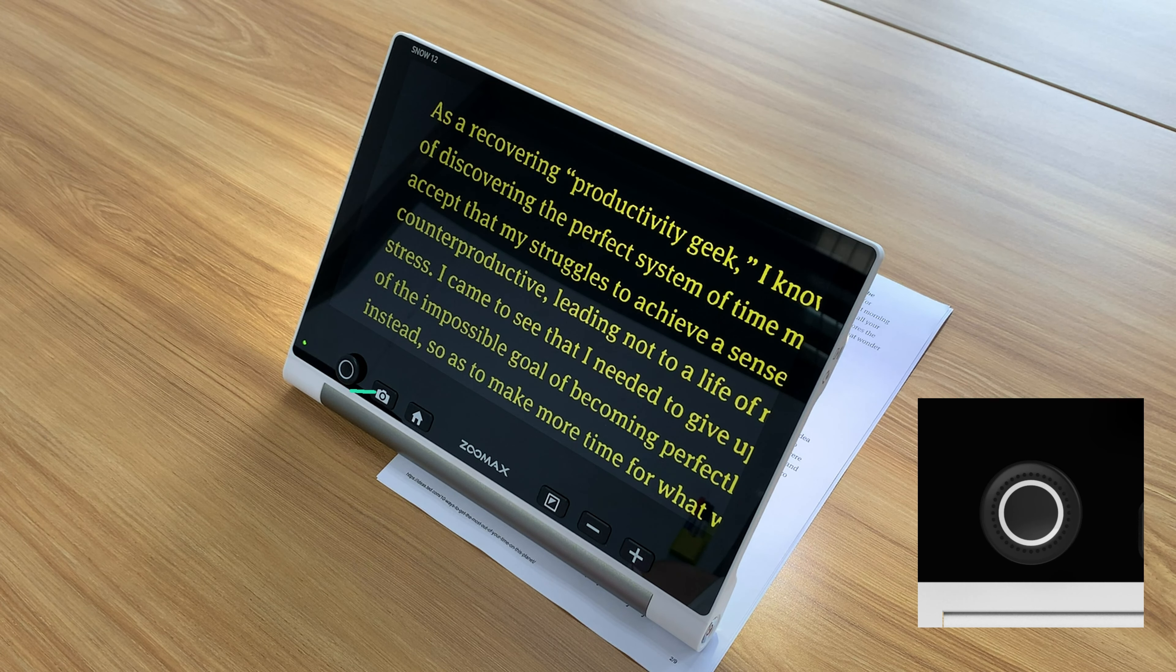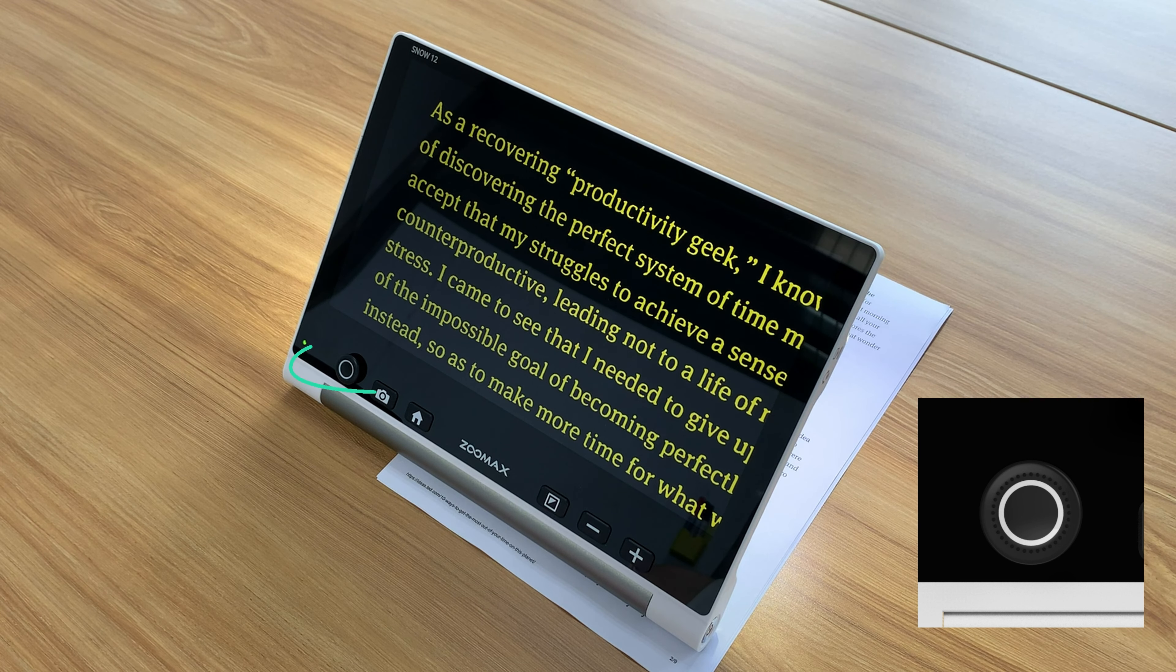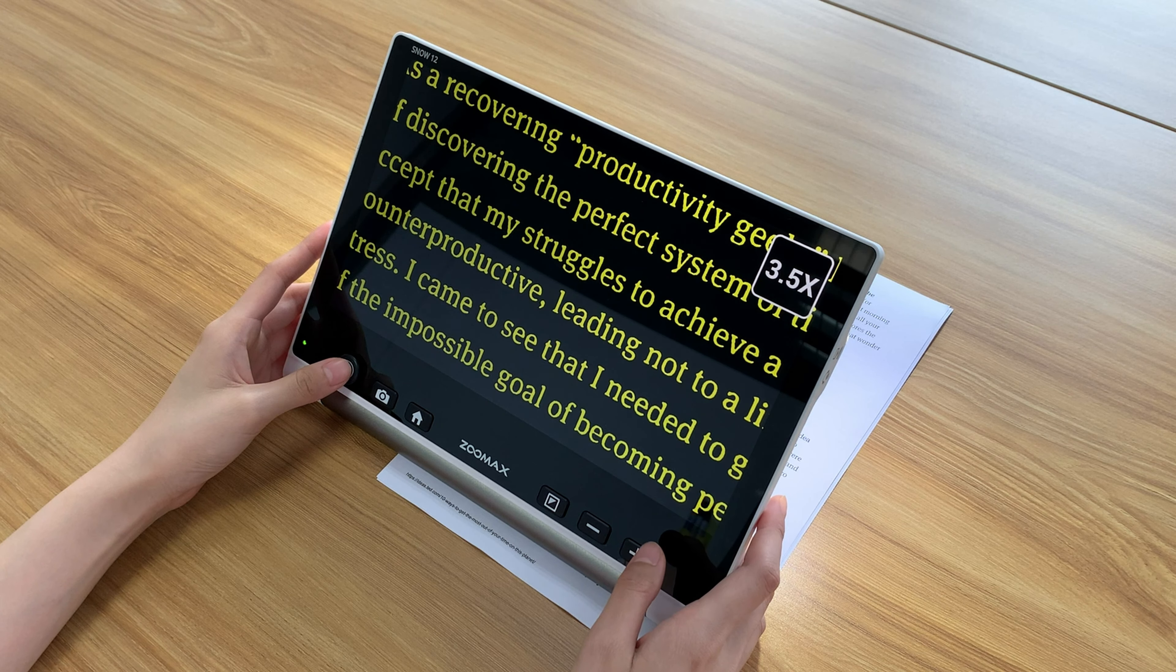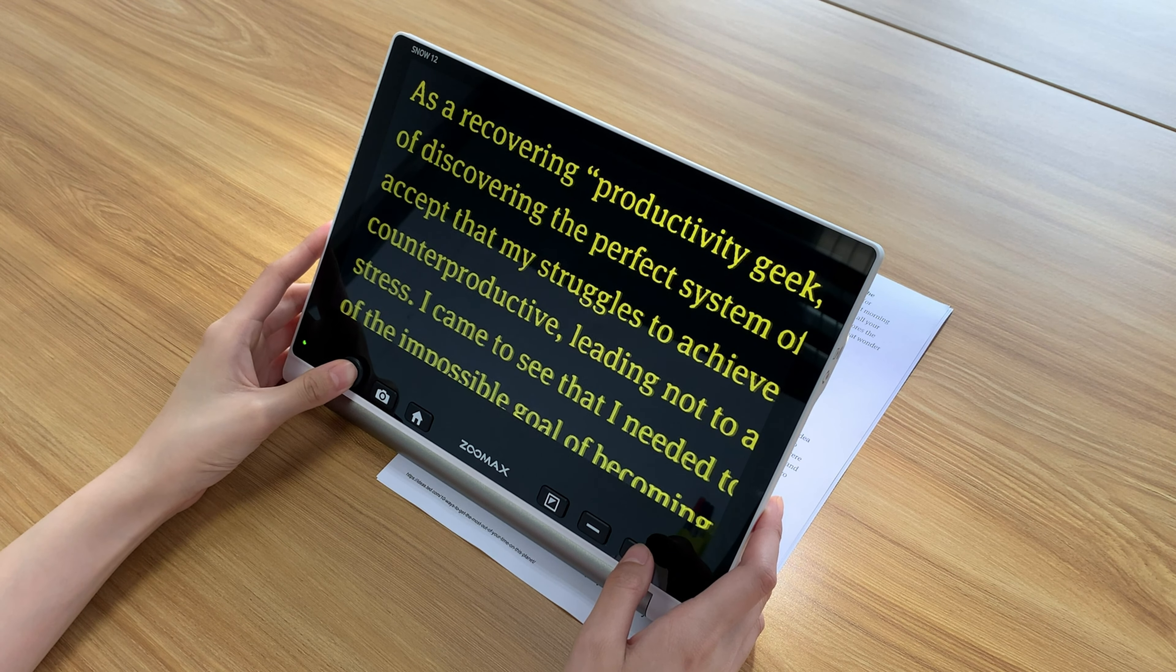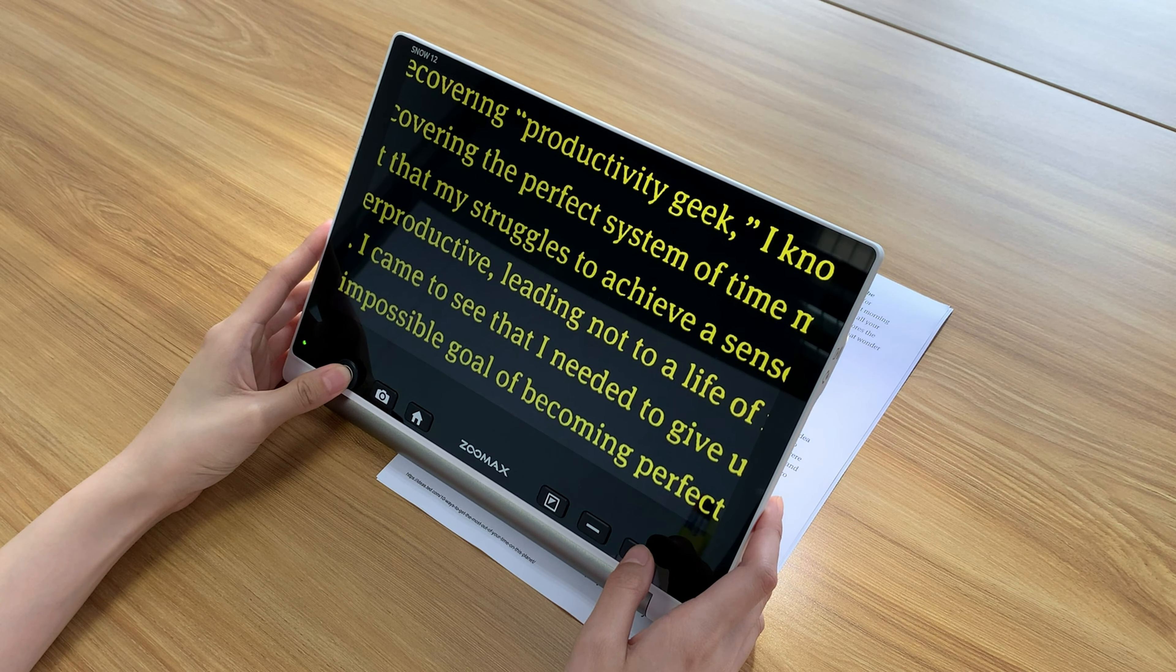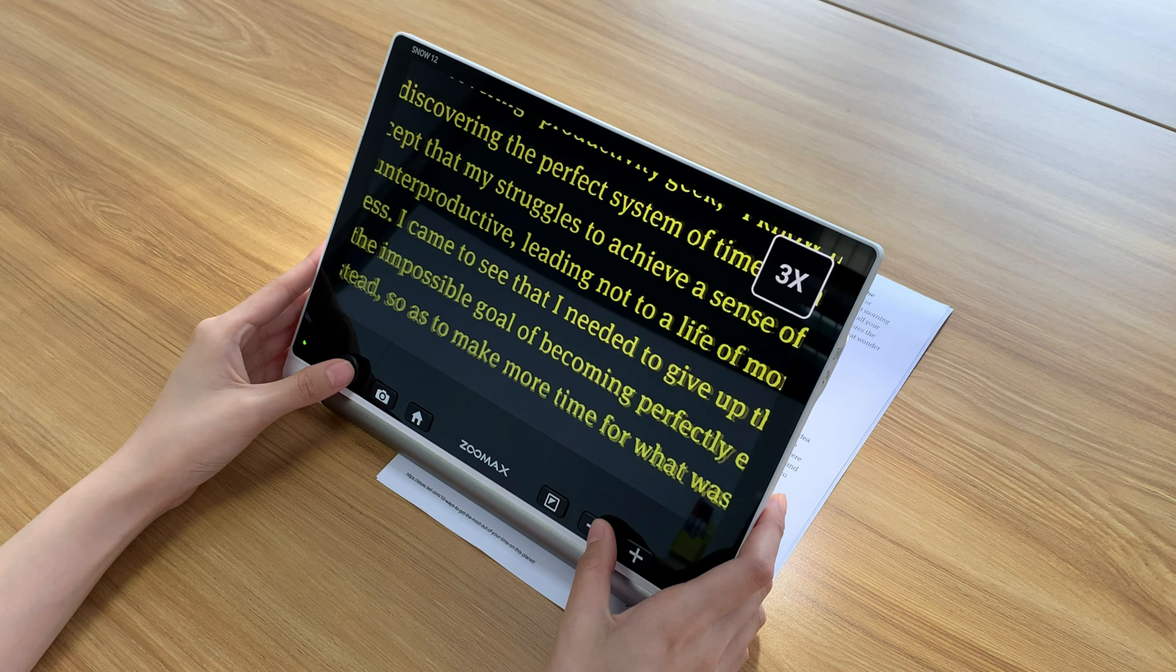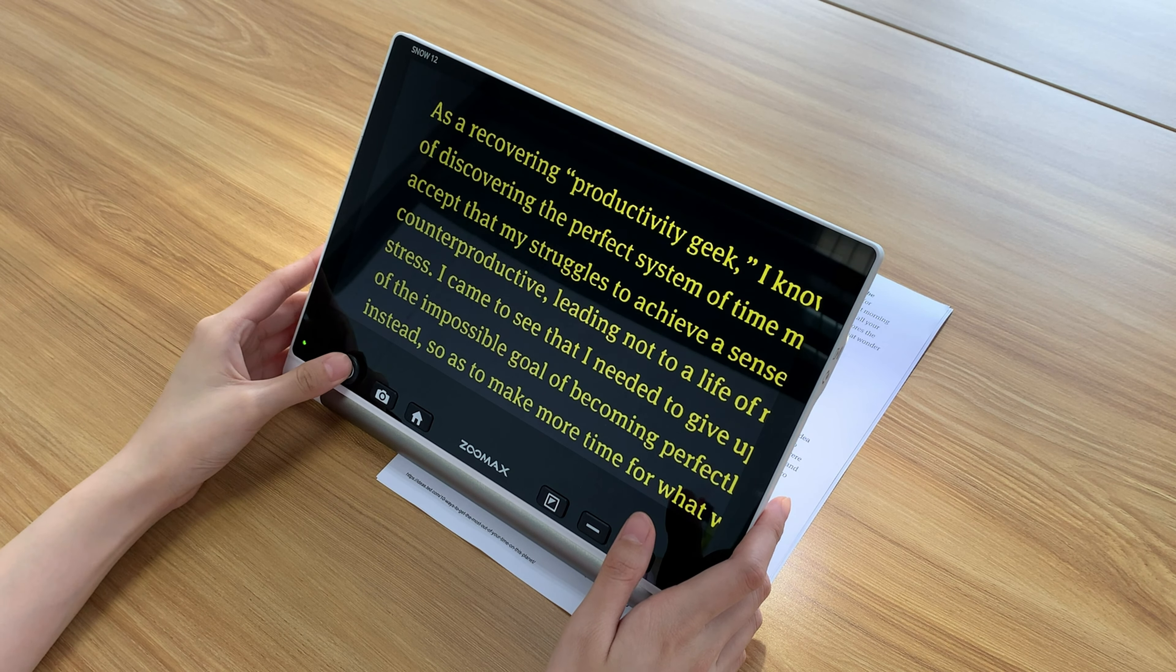Without moving the device or the reading material, the joystick helps panning around in real-time reading. Choose the image you want, zoom in to magnify the content, use the joystick to read up and down, right and left. Keep in mind that joystick will not be activated if you do not magnify the content.